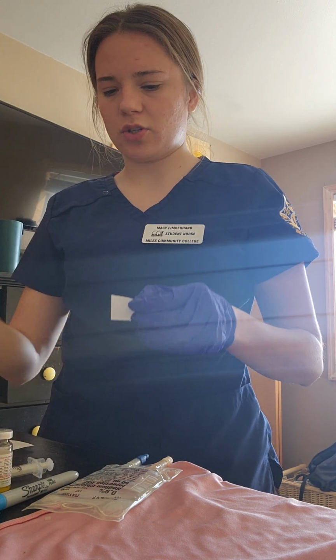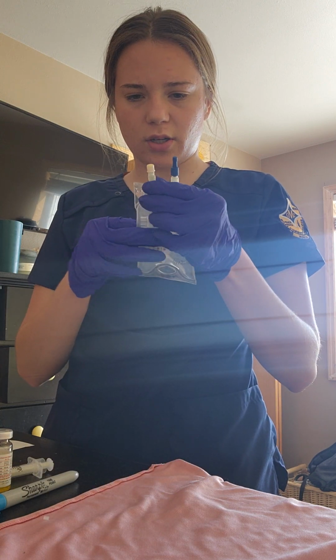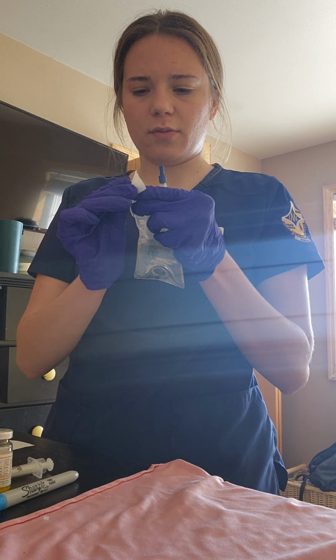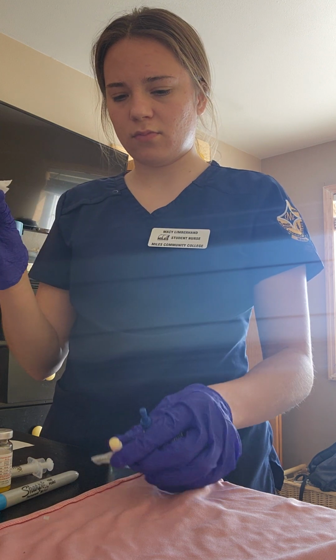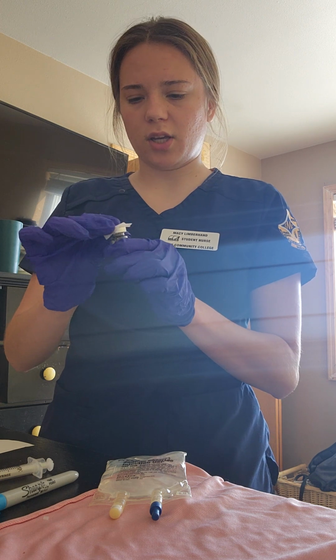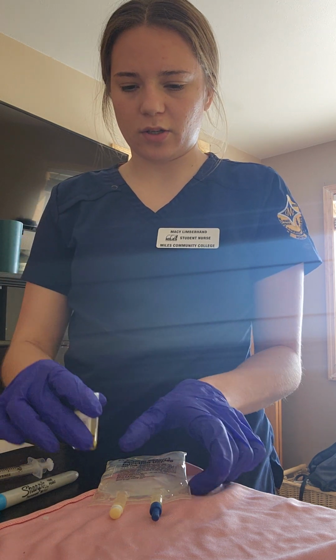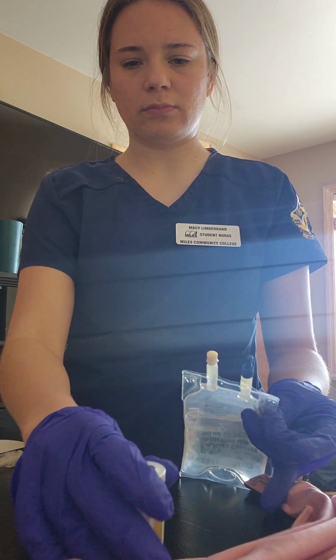Okay, so I'm just going to wipe off this part of my IV bag, let it dry, and then also of my medication. I will let both of those dry.